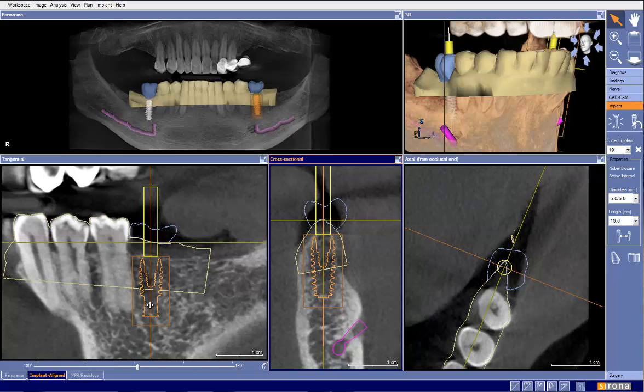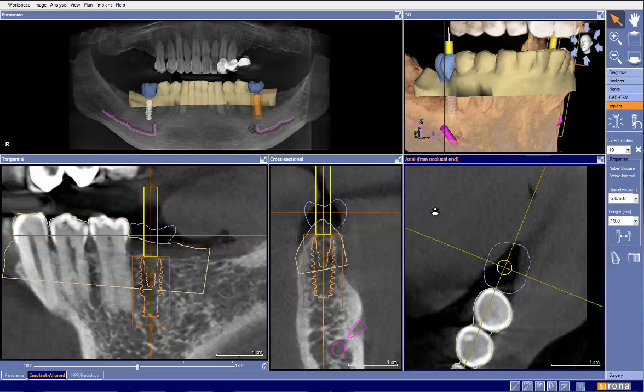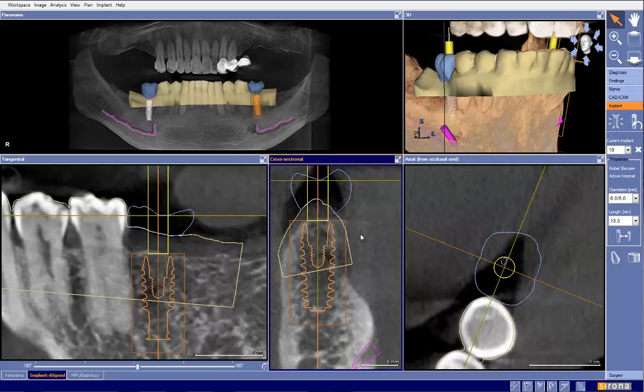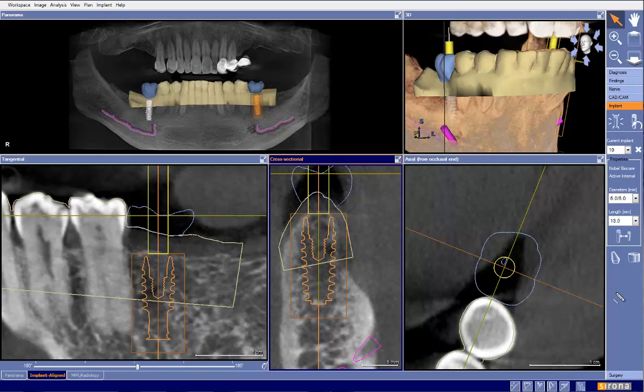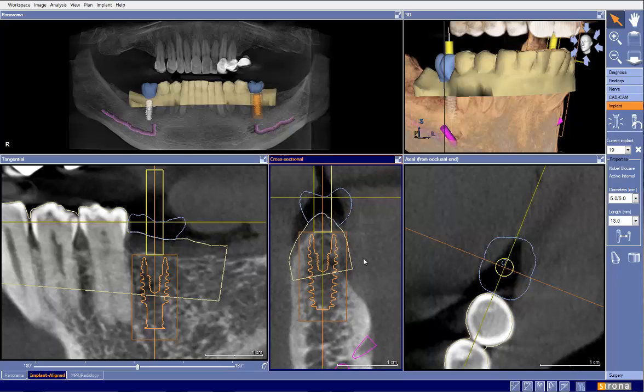Now in this case, everybody's going to be a little bit different, but I'd be pretty comfortable grafting this at the time of placement. The areas that I would be worried about with the graft are right in here. But again, this would be another great use for some bone expanders, maybe to at least expand out the crestal third or crestal half of the osteotomy.